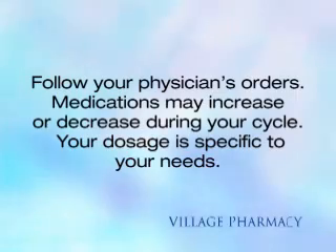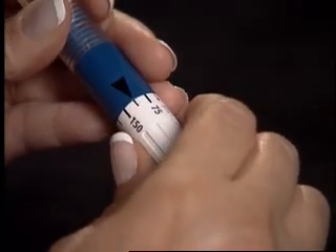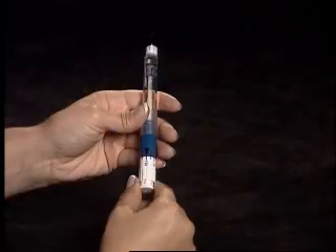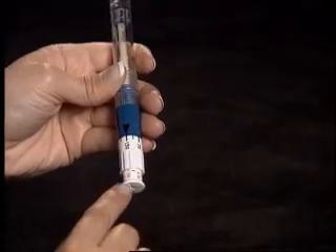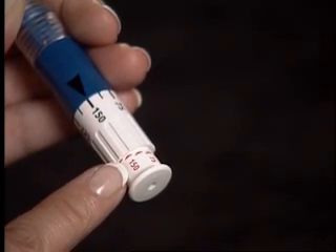Always follow your physician's orders. Medications may increase or decrease during your cycle, and your dosage is specific to your needs. For demonstration purposes only, we will be using 150 international units. Turn the dial to your prescribed dose, making sure that the amount is lined up with the black arrow. Load that dose by pulling out the injection button as far as it will go. Confirm by looking at the red dosage confirmation scale — the last visible flat red arrow indicates the loaded dose.